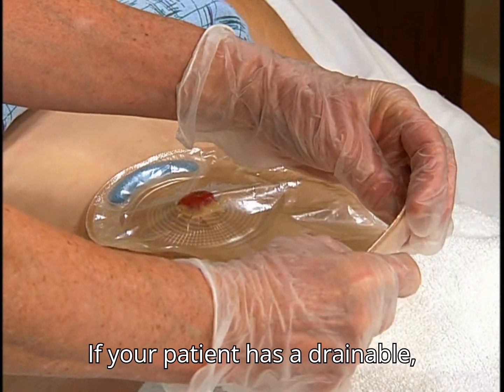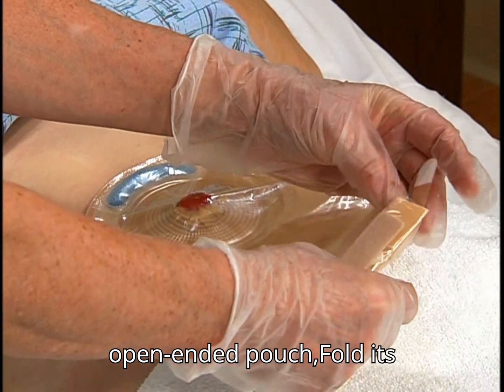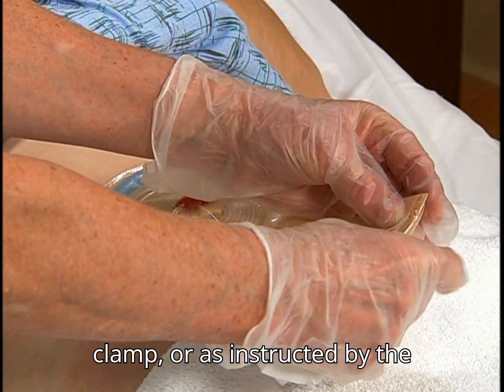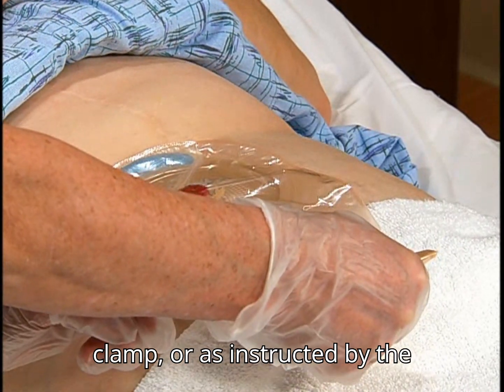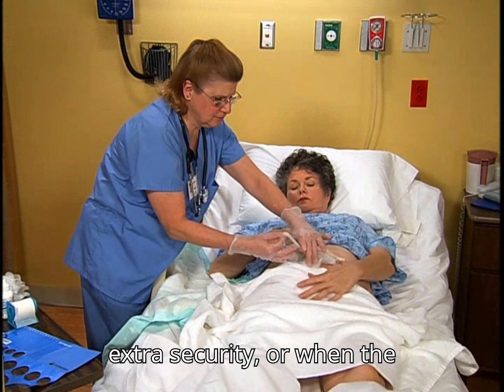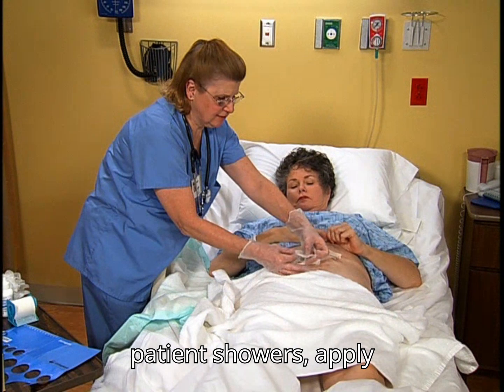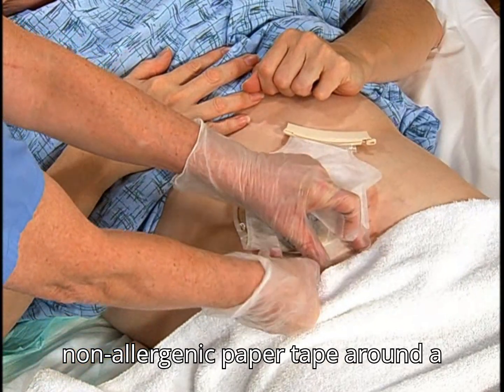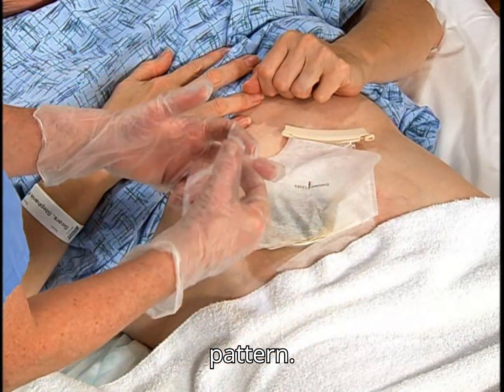If your patient has a drainable open-ended pouch, fold its bottom up once and close it with a clamp or as instructed by the manufacturer. For extra security or when the patient showers, apply non-allergenic paper tape around a pectin skin barrier in a window frame pattern.